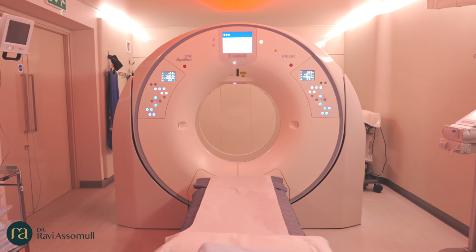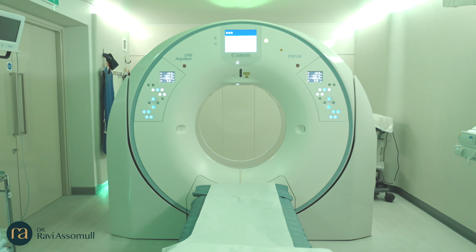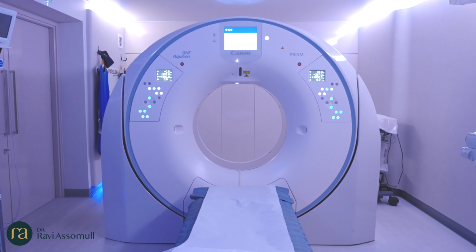This is clearly a concern. However, we can reassure you that we use the latest generation scanners which have a fraction of the radiation exposure compared to the initial scanners we used to use. For example, our scanners will acquire all the images needed in a single heartbeat.